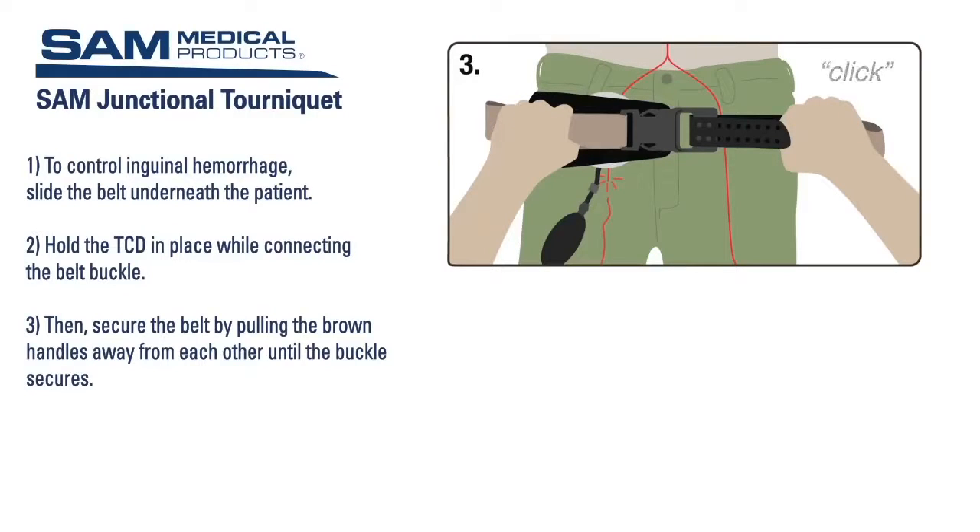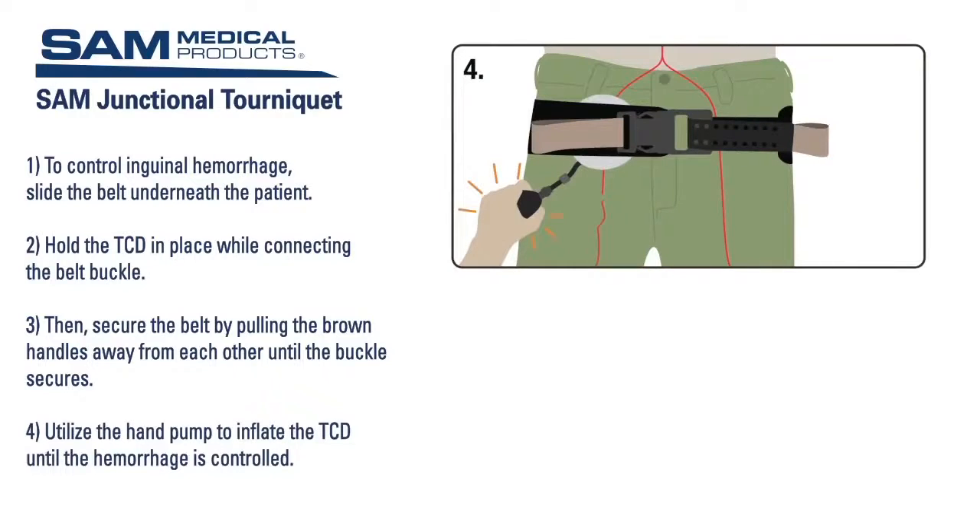You will hear an audible click. Secure the excess strap by pressing it firmly back down onto the Velcro on the belt. You may hear a second click once the belt is secure. Now utilize the hand pump to inflate the TCD until the hemorrhage is controlled. You can remove the hand pump from the TCD and use it to inflate an additional TCD if needed for bilateral hemorrhage.